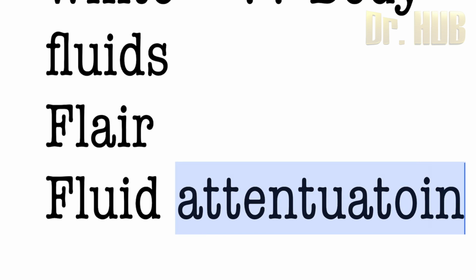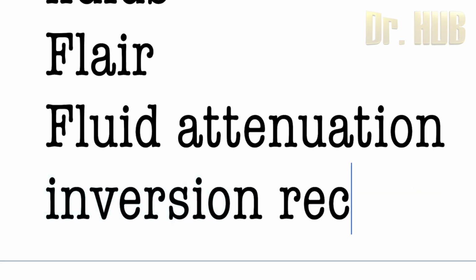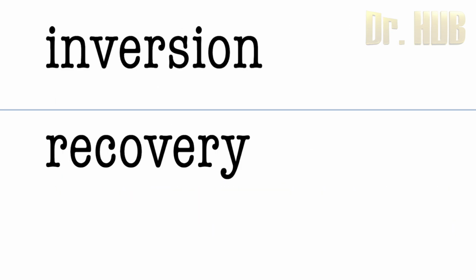Next, moving on to the FLAIR. First we need to understand what is the full form of FLAIR. The FLAIR includes the fluid attenuation. It is nothing but the fluid attenuation, inversion as well as the recovery. So fluid attenuation inversion recovery is nothing but the FLAIR.